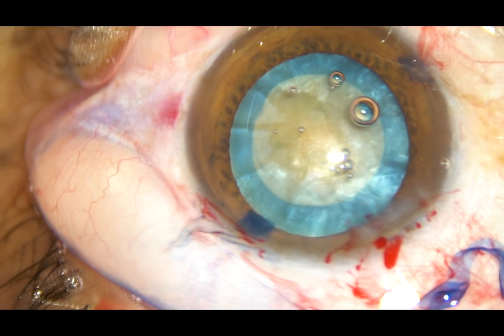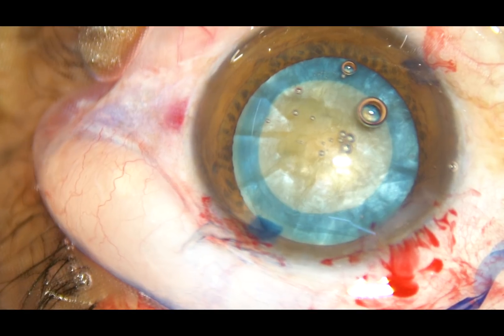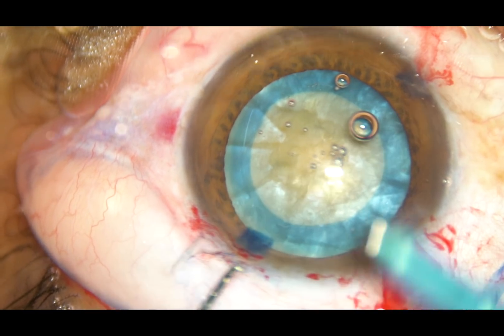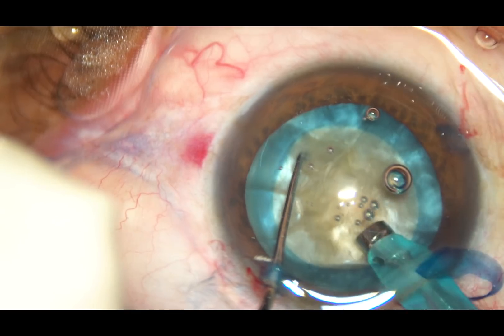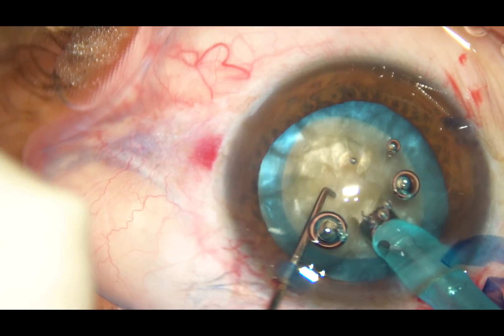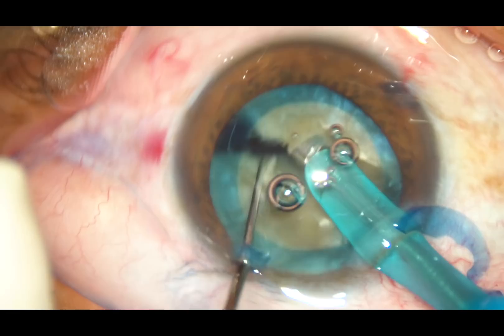And now, in intumescent cataracts, we know hydrodissection is not required. A little amount of viscoelastic substance has been injected. And now I'm going into the anterior chamber with the tip of the FACO handpiece. This is the FACO machine. My plan is to do direct chop — so what I do is, I bury the tip into the substance of the nucleus and hold the nucleus very firmly and chop it.